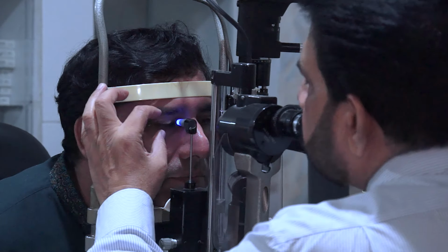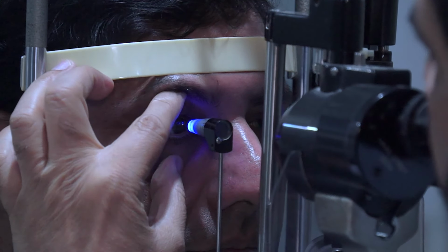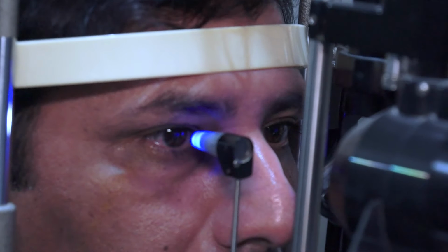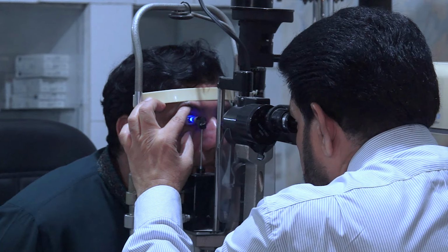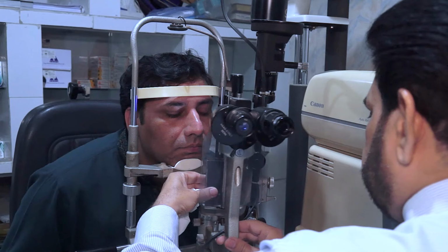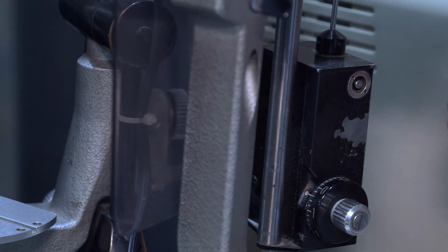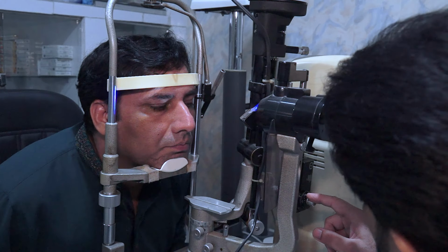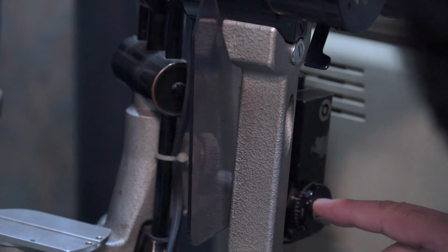In this the tear film appears greenish, and then we see through the illumination system these green, they appear to be broken rings. This is how we are going to do an applanation tonometry with this Goldmann tonometer. This is to check the intraocular pressure of the eye. Okay, and after checking the intraocular pressure, we can read it from this dial, and it is about, this is the 10 and then 12, and then each graduation is equal to 2 millimeters of mercury.